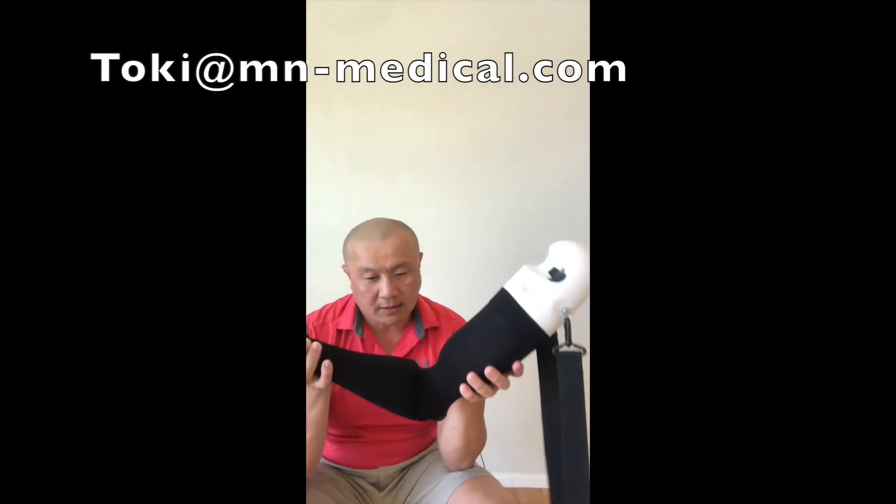Hello, Toki from M-Medical. Finally, the final Elbow Dislocation Simulator 3D print came out — looks great.